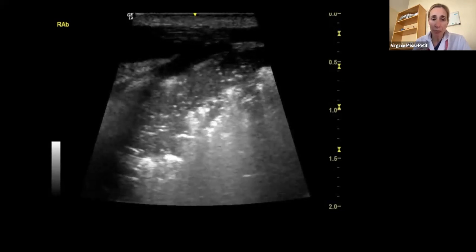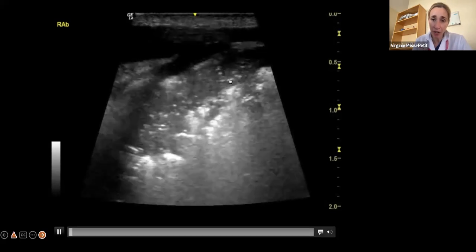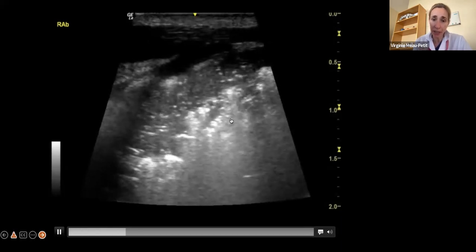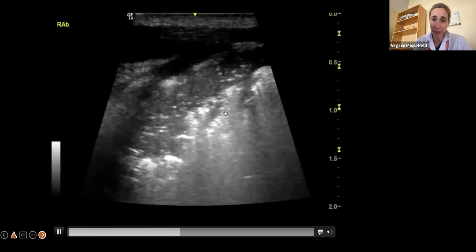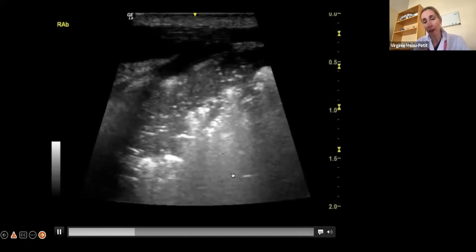So we turned the patient prone to put this consolidated area on top, and we started with very low increments to increase the PEEP. And you can see this opening like a flower, this opening of the consolidation. And this area of white lines behind it was actually, I didn't know, but that was a sunray pattern.